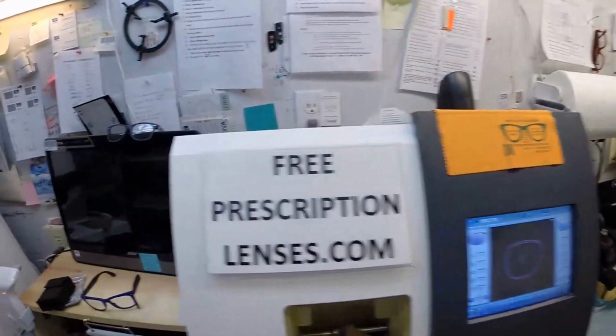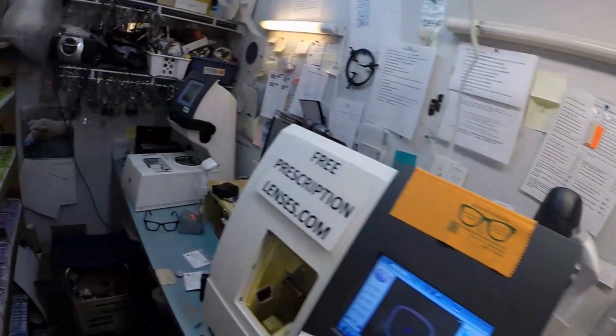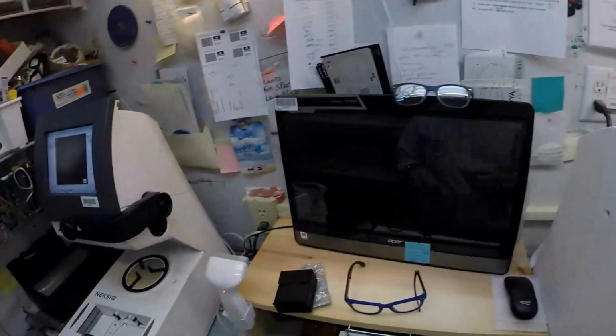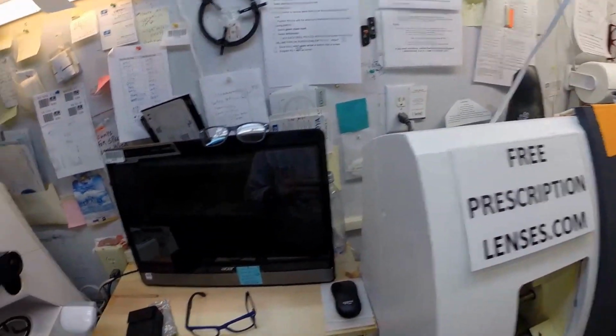I'm going to open up the chuck and grab a paper towel to dry this off. Now, let's see if this will fit first time around. I'm a little bit skeptical. Usually on the Wayfarer frame with its deep bevel, I have to take it down a little bit more, but let's see. I actually want to use my thumbnail and make sure all that optical debris is off the lens.